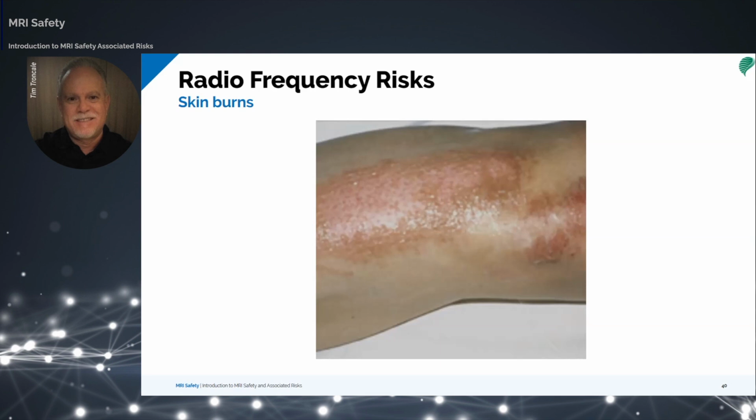As mentioned, it is important to provide a minimum of 1/2 inch or 10 millimeters of distance padding between the body part and the bore. Therefore, again, a single sheet layer or even clothing against the side of the bore is not enough, especially if there is perspiration that is enough to make contact and cause arcing.